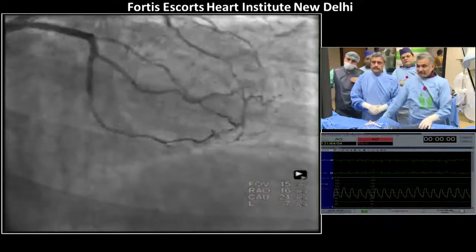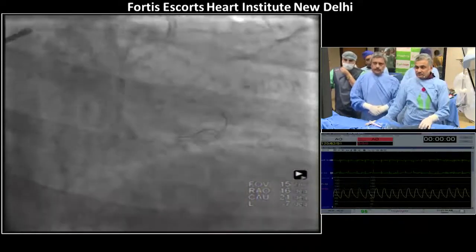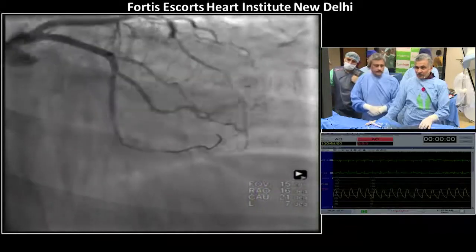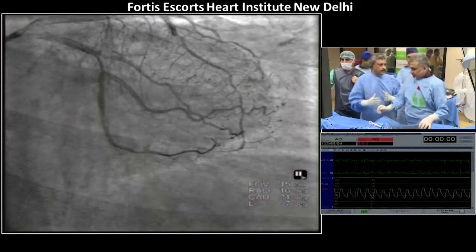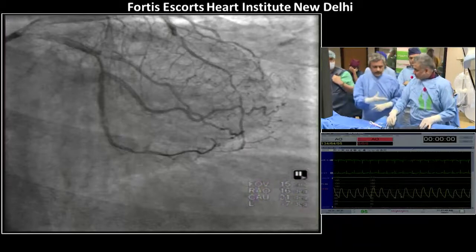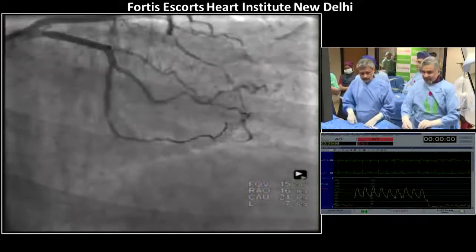That's fine. Only thing is that before putting in a stent, would you dilate the previous stent first? Yes, we would. It is underexpanded. That's the issue. Yes, absolutely. Shall I take an aggressive 2.25 balloon or 2.5 balloon? 2.5 NC. So maybe the distal we will dilate with 2.25. Yes, the artery is not that big. A 2.5 high pressure balloon.